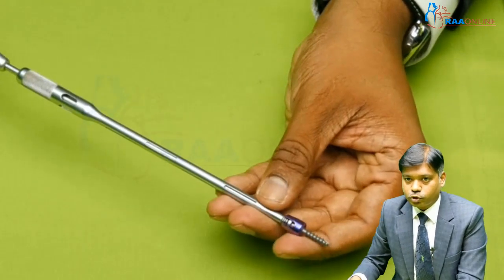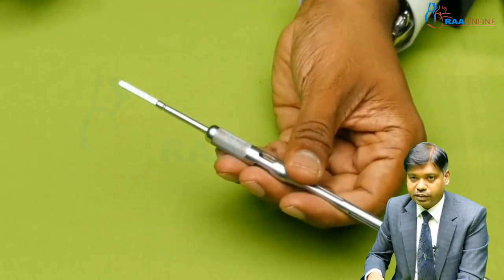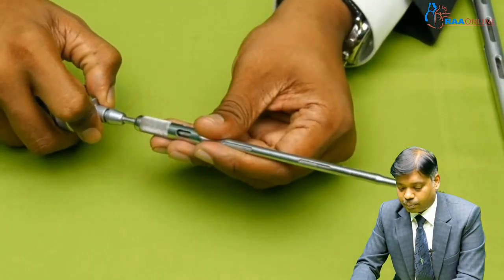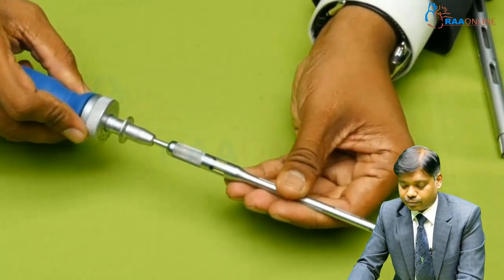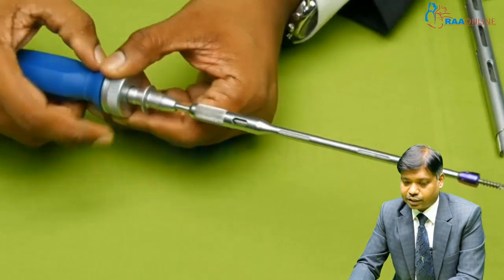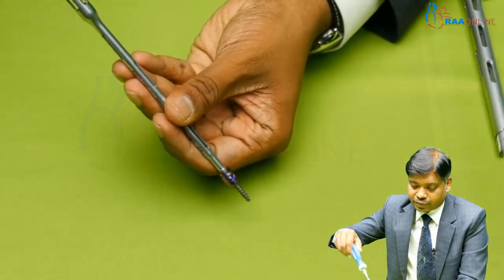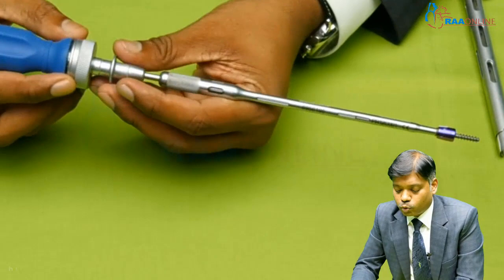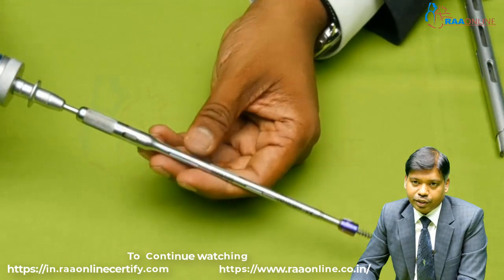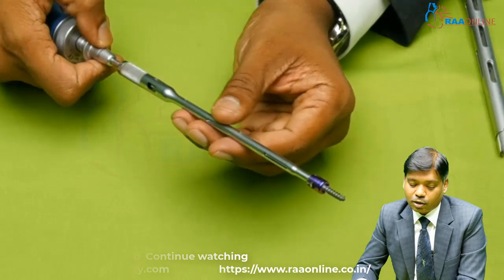This is how the screw is loaded in the screwdriver. As you can see, this can be detached like this, and you pull it up, place it inside, lock it, and check it before inserting. Again, these are the mechanisms we discussed: forward, reverse and ratchet. These clicks are for that, and then you place the lateral mass screw and gradually insert. I personally do not use the ratchet for the cervical spine because I want total control of the screw when it is going inside. So I always use the forward turn instead of a ratchet for cervical spine lateral mass or pedicle screws.